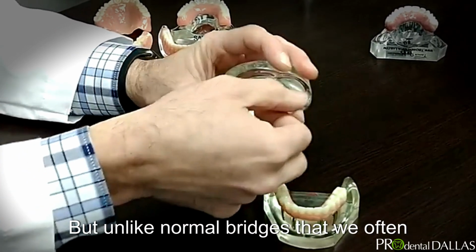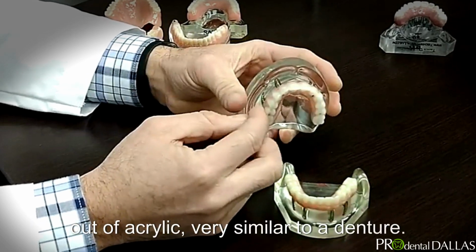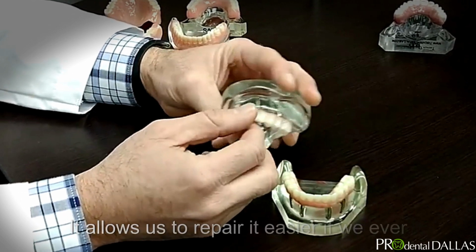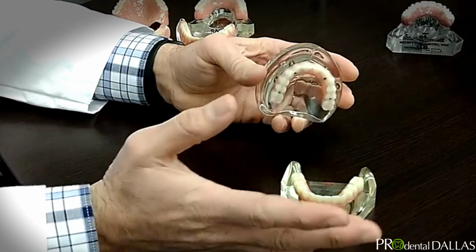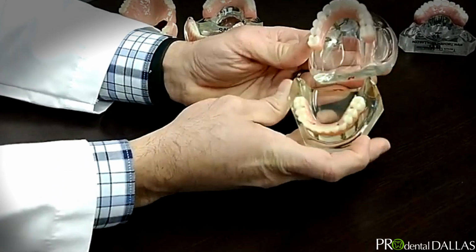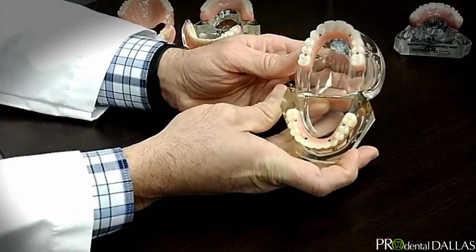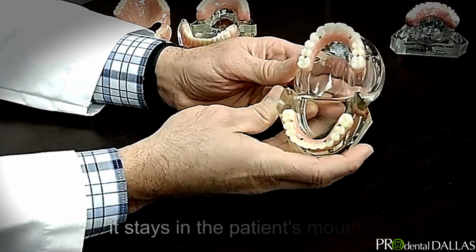But unlike normal bridges that we often have made out of ceramic, this one is made out of acrylic, very similar to a denture. It allows us to repair it easier if we ever had to. It allows us to keep it clean. It allows for a few things. But once you have teeth such as this screwed in place, it stays in the patient's mouth.